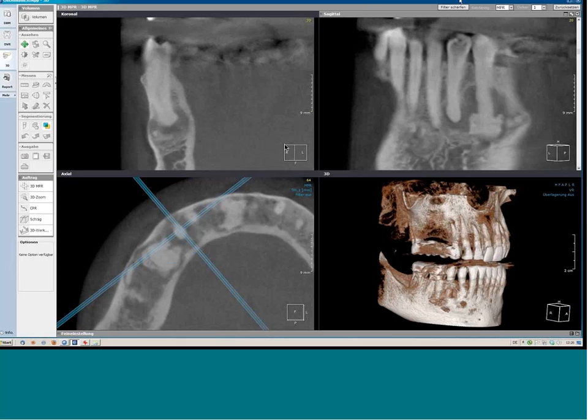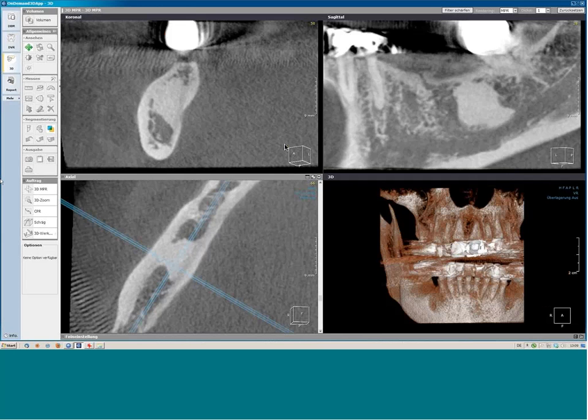And another case here, let's say cementoma. And once again, the typical question which is asked with regard to the preparation prior to an implantation is, can I insert an implant there or not? I can only tell you that I wouldn't recommend this region for implant insertion, because you don't know what you will expect here.